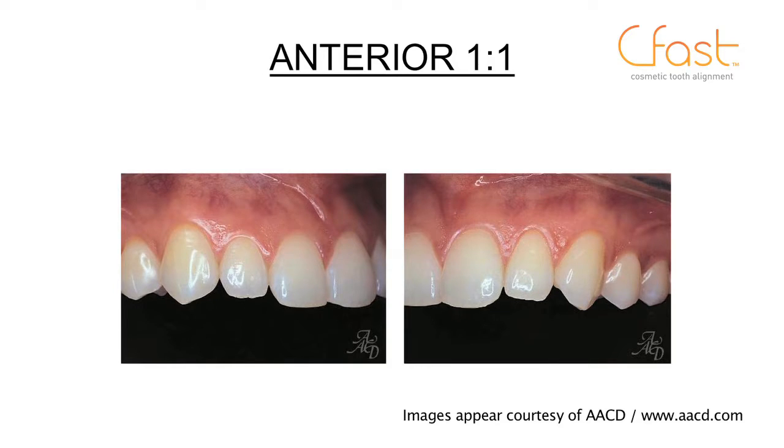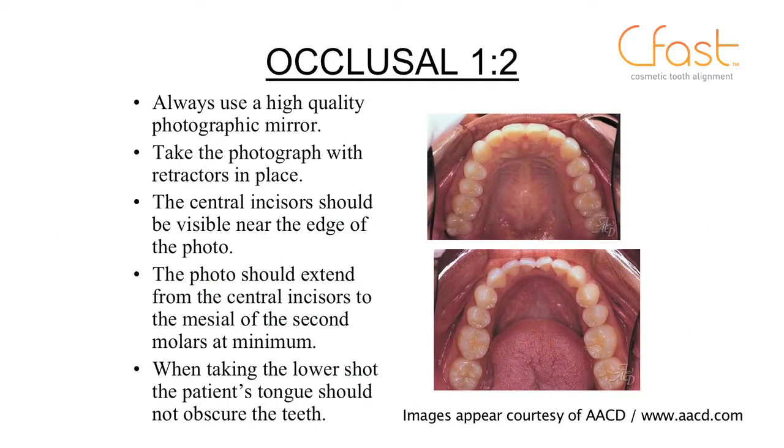And so from here, this is when most people tend to get a bit concerned, because then we look onto our occlusal views. Now, occlusal views are essential. They are a little bit trickier, a smaller learning curve, but absolutely achievable with a little bit of practice, and we'll look at how we take those. But that's an example of an occlusal view, and probably the most powerful view for our cosmetic orthodontics as well as for restorative dentistry, to show patients actually what's happening in their mouth.